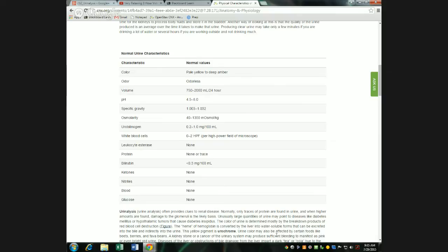There is genetic variation within the human population, if you weren't aware of that. And so there are some people that carry a gene that produces a molecule, a breakdown product of some metabolic reaction, that at room temperature will precipitate out of urine. Okay. So in your body, it's not doing that. At body temperature, it stays in solution. After you've taken your sample, it's been sitting in the back. If you have this particular genetic difference, you will have a cloudy sample.